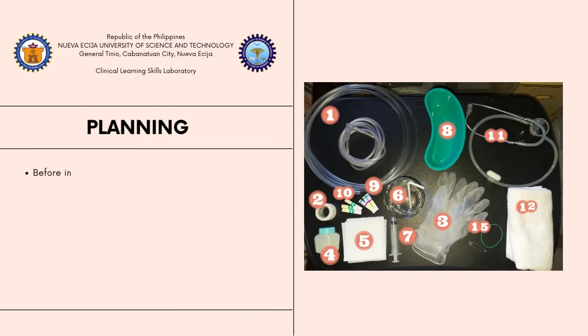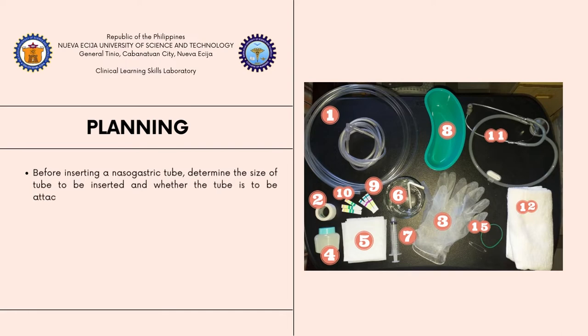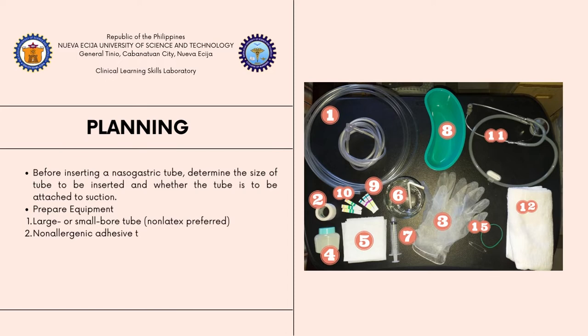Before inserting a nasogastric tube, determine the size of the tube to be inserted and whether the tube is to be attached to a suction. Then, prepare the following equipment. First, a large or small bore tube and a non-latex tube is preferred to prevent any allergic reaction. Second, a non-allergic adhesive tape or a micropore tape that is 1 inch or 2.5 centimeters in width. Then, clean gloves, a water-soluble lubricant.